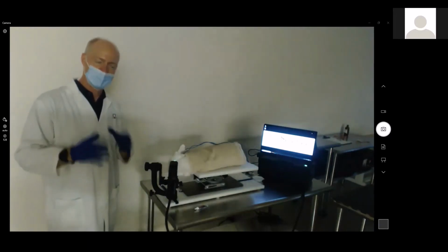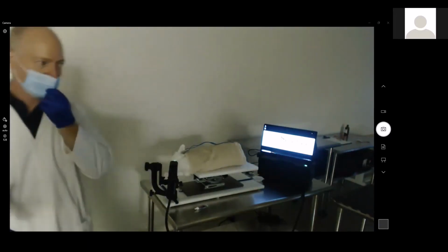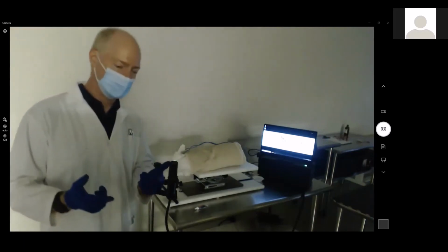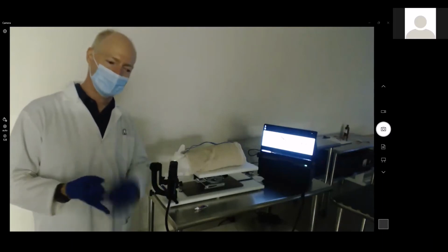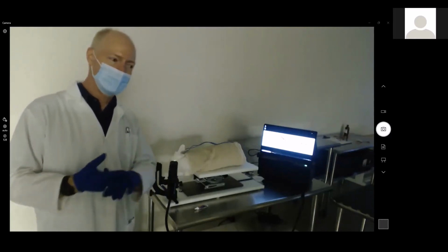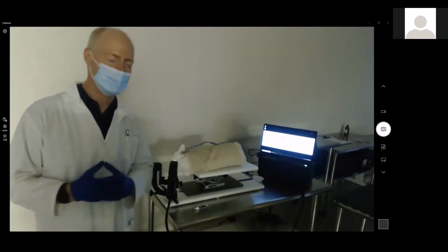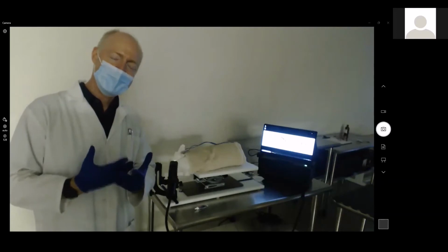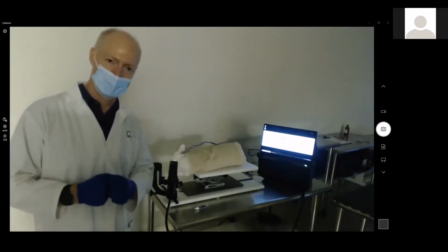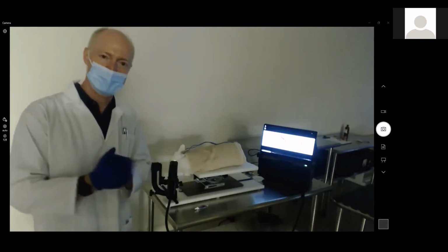The benefit of doing the awake OCT is you get gross anatomical representation. For example, it works really well in cornea. When you've got something that shows clearly there's an opacity or any type of aberration on the cornea, when you use the OCT on the anterior, it really illuminates. It has very clear detail. And it's actually pretty simple to capture because you're just looking at the cornea and putting the OCT on the cornea.